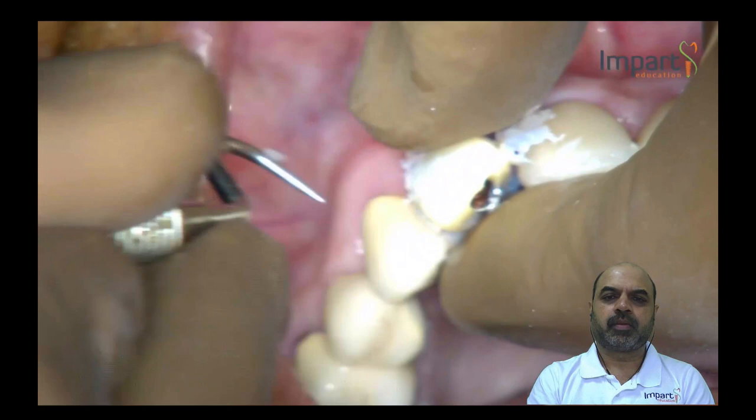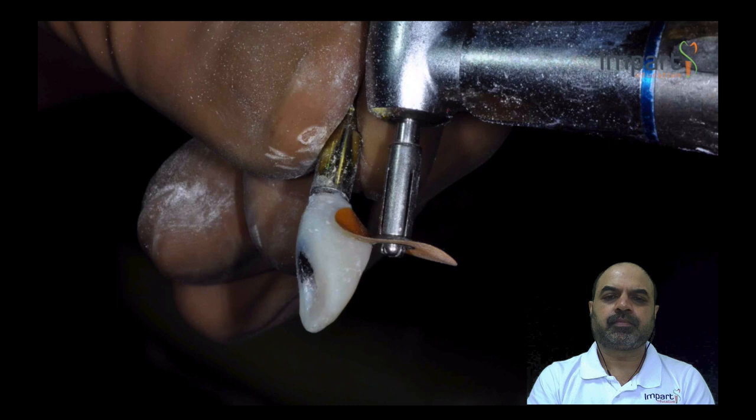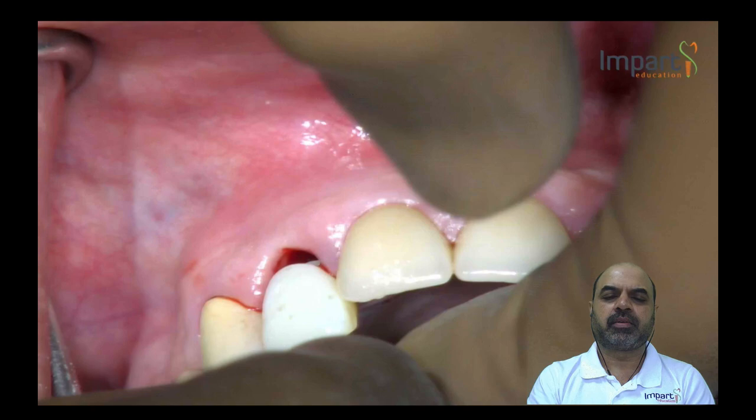The crown is now retrieved. We then attach it over an analog, fill up all the voids with flowable resin, and then using composite finishing tools, we will then finish and polish the restoration and provide it the much needed contour. After the final glazing is done, the restoration is now placed over the implant.